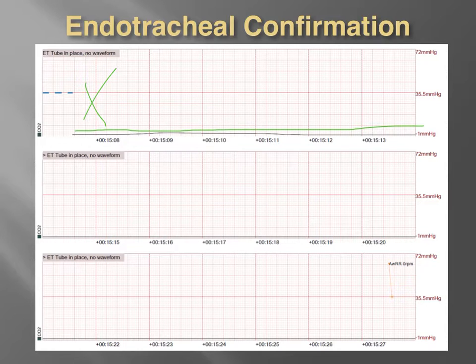We were new to utilizing the capnography in a much more aggressive fashion than we had in the past. If you remember, we originally started out with just intubated capnography versus non-intubated, and this is a great example of why we need to apply capnography more often. We were in this transition phase, and we had a lot of people that were resistive to the efforts being concerted with non-invasive use. Ultimately, the most important thing is that we're getting exposure to our paramedics and our EMTs with understanding what they're looking at.